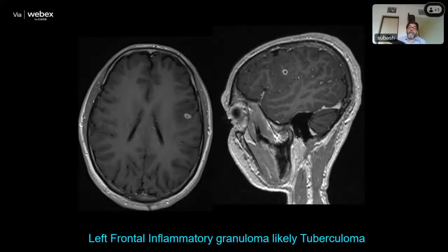So this is a very interesting appearance of tuberculosis of the brain, and believe me, before MRI arrived in diagnostic imaging, most of these patients were unattended. They used to get paralyzed, they used to get functional deficits, but nobody knew what was happening with these patients. The same thing happened with neurocysticercosis. There are these small lesions in the brain, but they were not visualized by any other technique. So these patients were treated by chance. They would be treated for different diseases to see which treatment would fit them best.